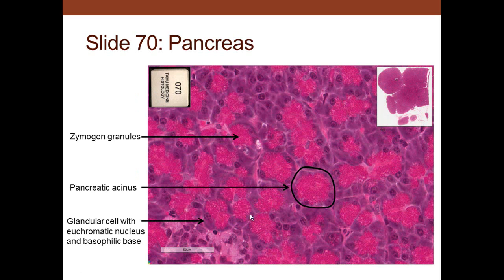Here's a pancreas, and these cells are more pyramid shaped, so they'd be more like maybe cuboidal, but they're certainly pyramid shape. Here's a group of them. On the base you see the nucleus, but also see the blue cytoplasm of the cell. In the apex near the lumen, we can't see the lumen. This is a cell in the lumen, nucleus of a cell starting a duct, so this would be the lumen right in through there, and the red granules are actually secretion.